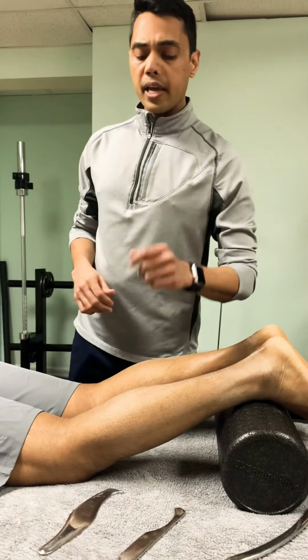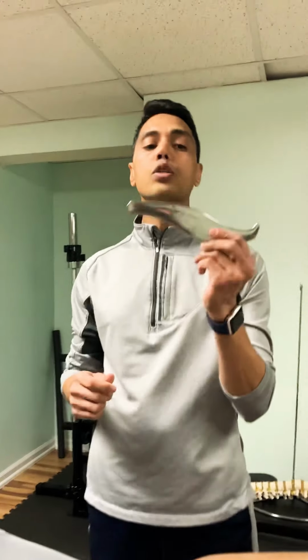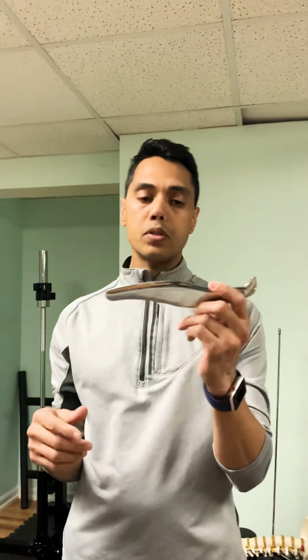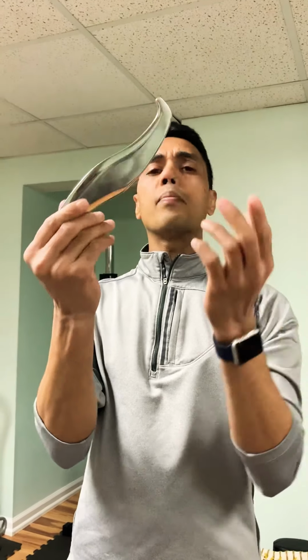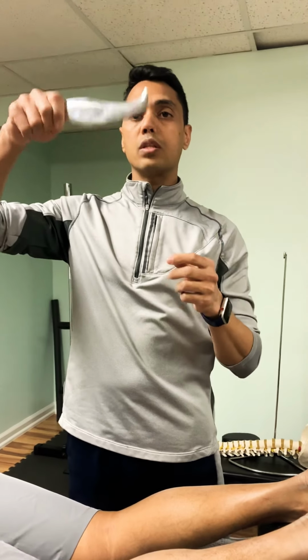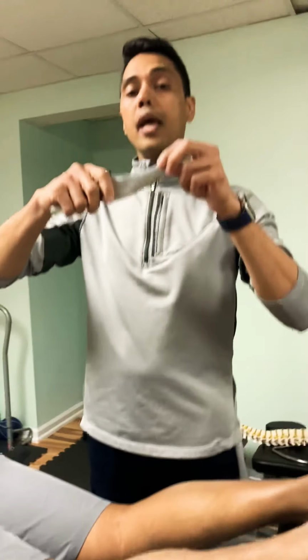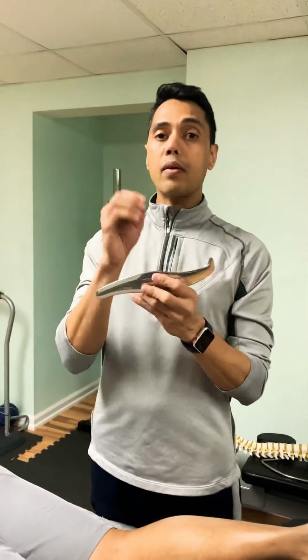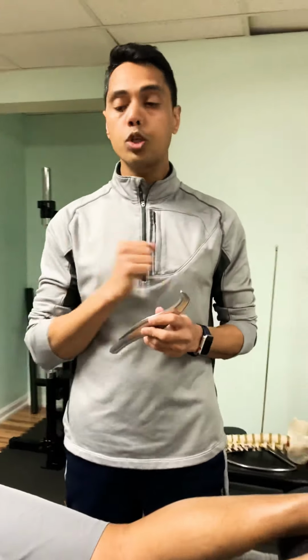The reason why IASTM is useful is because these tools are designed in such a way that they have different contours. All these contours are for a purpose. All these edges have a purpose. You cannot use your fingers and dig into the patient. This gives you a lot of chances to use it in a better way. It also has some weight to it, specifically designed so it can penetrate the superficial fascia and the deep fascia based on the direction of pressure and the speed. It alters different areas and receptors of your nervous system, causing different impact based on what you want.